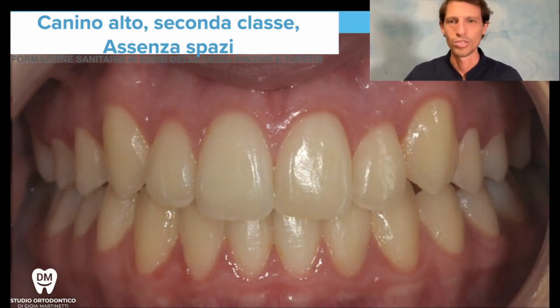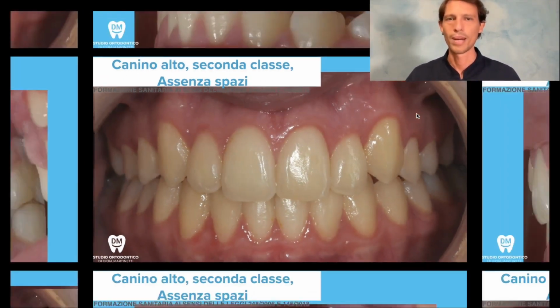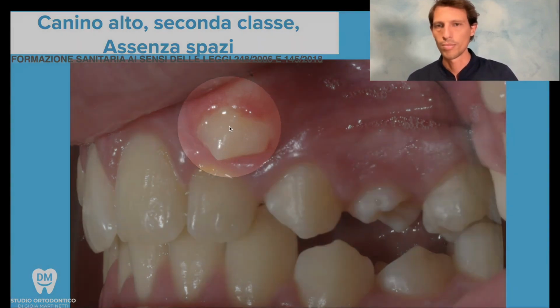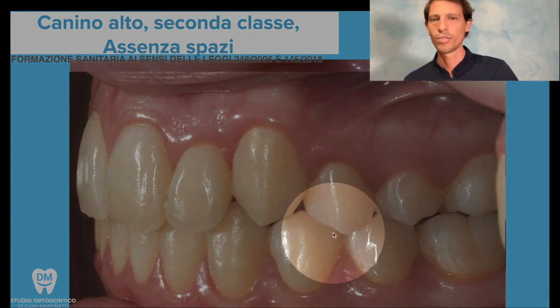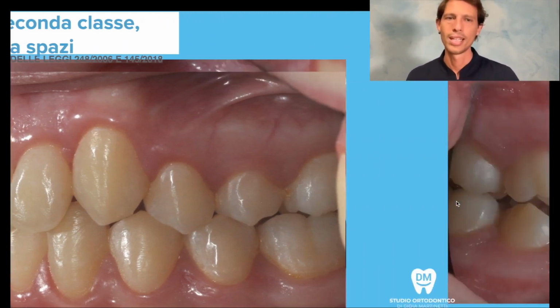Look at how wonderful this situation is. Here, straight teeth, the midlines are practically aligned, and the canine has been put back in its place. Look at this here. We haven't just changed the aesthetics, which is certainly very important, but also the bite by restoring the guidance of this canine to where it should be, that is, behind the lower canine. Those teeth, you see, fit together perfectly, 1 against 2, just as nature intended. Nature would want it this way on the left, without extractions, without surgery, and the same on the right.